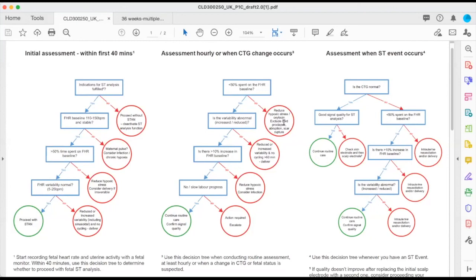Good answer. Surely you want it like every minute or something. So if you can check it every minute, that's amazing. If you can check it 3-4 times a minute, which is what the machine is supposed to be doing, that is perfect. But we don't live in a perfect world, do we?